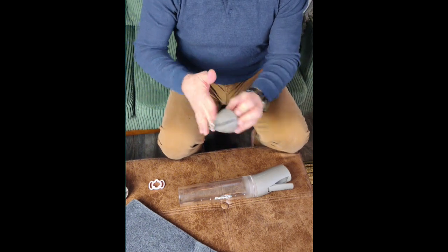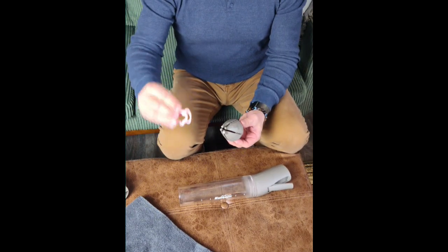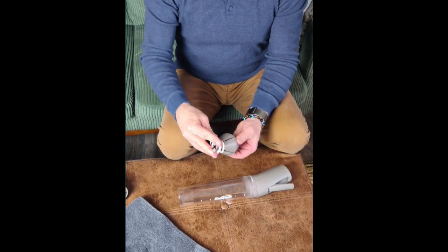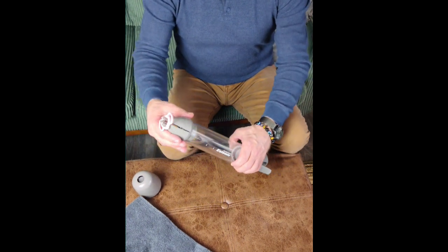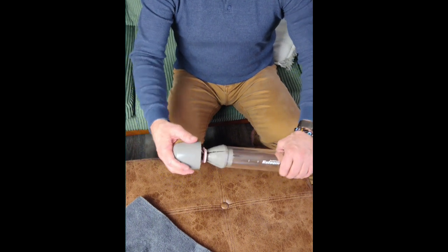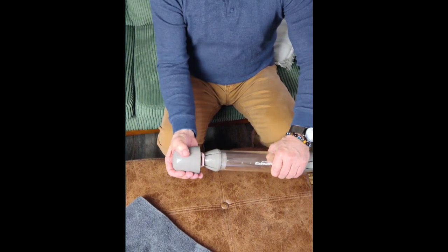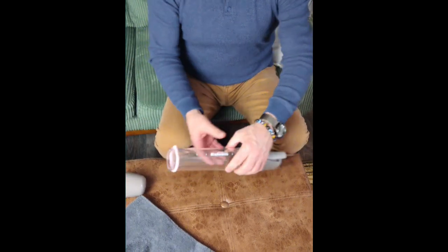So once I've got a good lubrication on there, I want to align the tension ring onto the device. I want to line up the bottom of the ErecAid tension ring with that little white dot. And then I want to place the device in the cylinder, and then you can see there that I can push down a well lubricated device, and then it will just align perfectly at the edge of the cylinder.